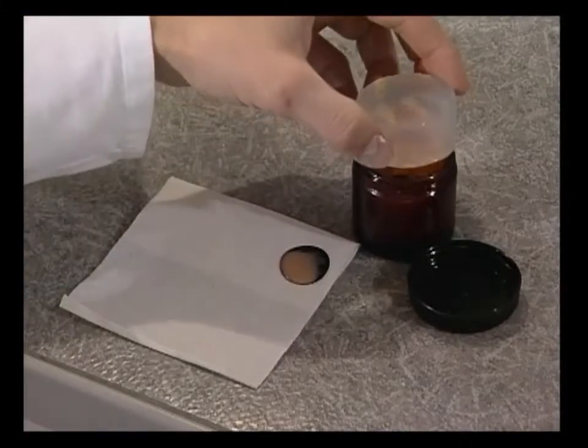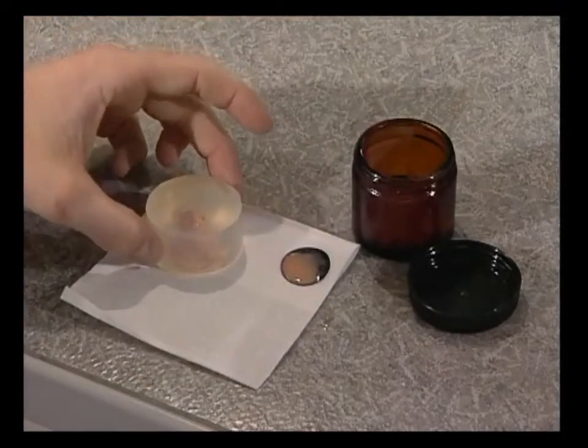The negative form is placed the other way around on a paper towel which absorbs any material that is still liquid.